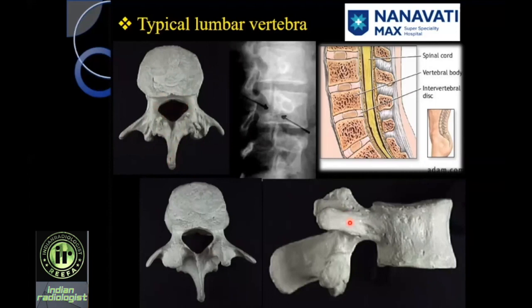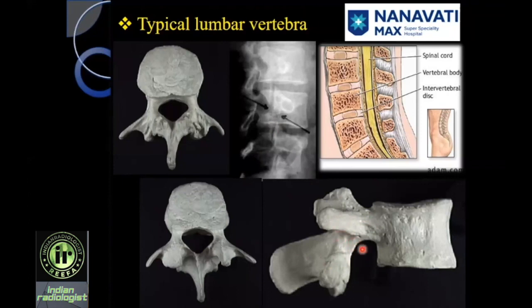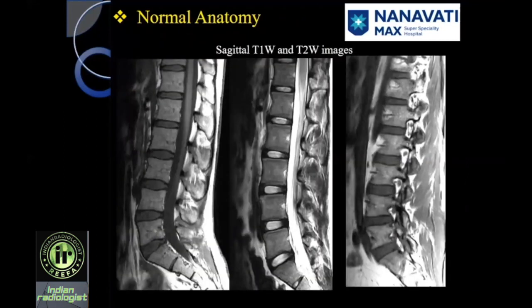From the side view, you can see the superior and inferior articular facets very well. This is the inferior articular facet of the L4 vertebra, and this is the superior articular facet of the same vertebra. This is the superior articular facet of L4 and this is the inferior articular facet of L3. This is the pedicle, transverse process, lamina, spinous process. And this is the area of the pars interarticularis, which gets broken in spondylolysis as seen here.